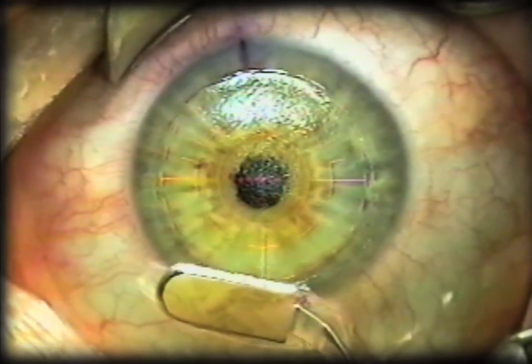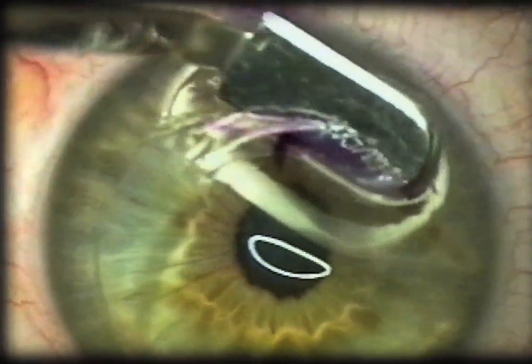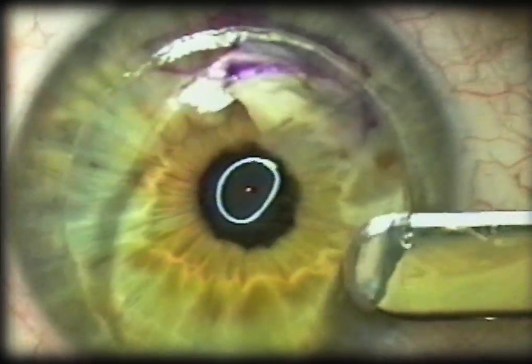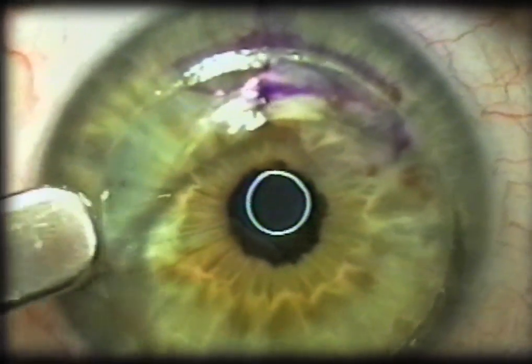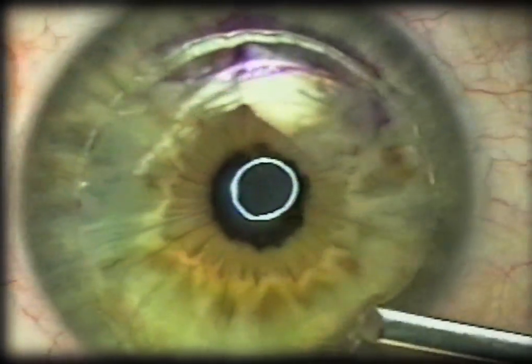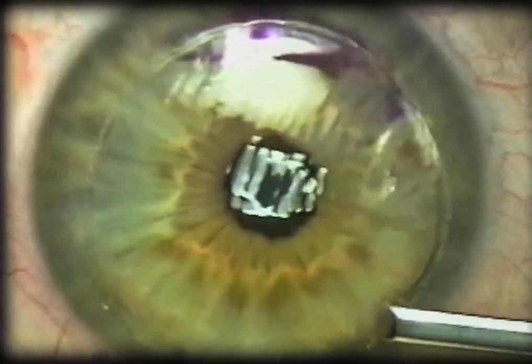Now with higher magnification, another enhancement case. You can see how that blade is sharp enough to cleave the epithelium in a fairly clean fashion and yet respect the original cut of the microkeratome and not create any new passages. The thin end is able to get in with the beveled end and then pass underneath and free up the adhesions between the flap and the underlying bed.